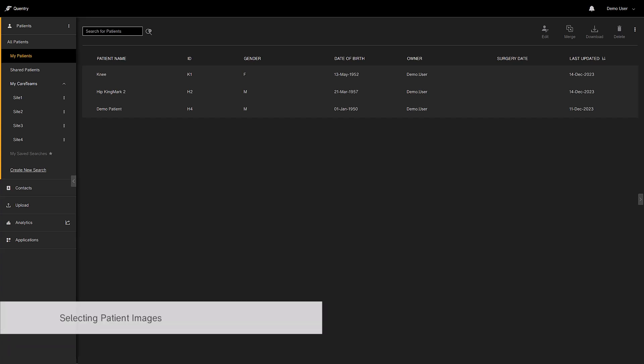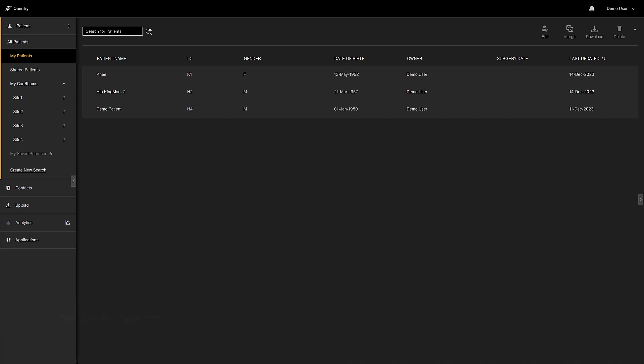Once you log into Quentry, you will see a list of patients. Start by selecting the patient that you wish to plan for.